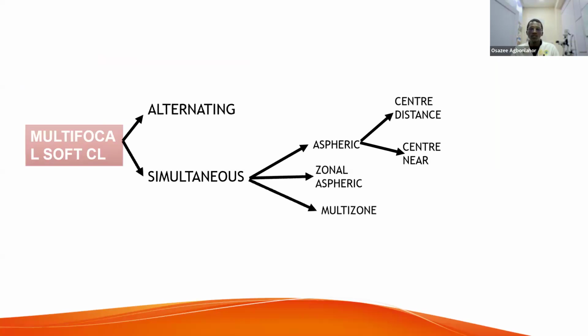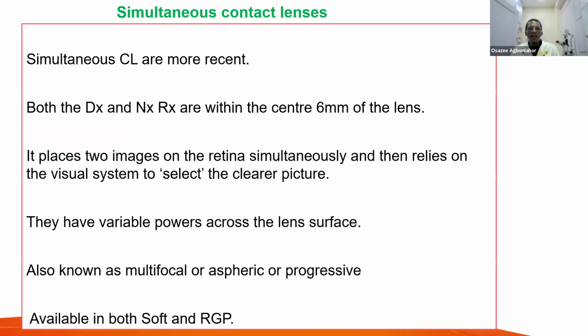What I've been doing before is just to give you a background. This is where the matter really is, we need to pay more attention to. So for simultaneous contact lenses, like I said, they are more recent.